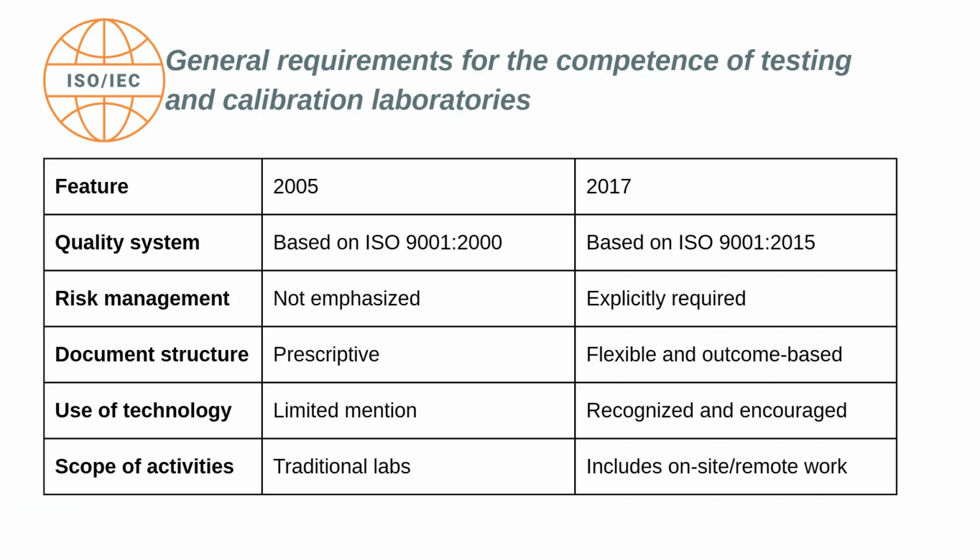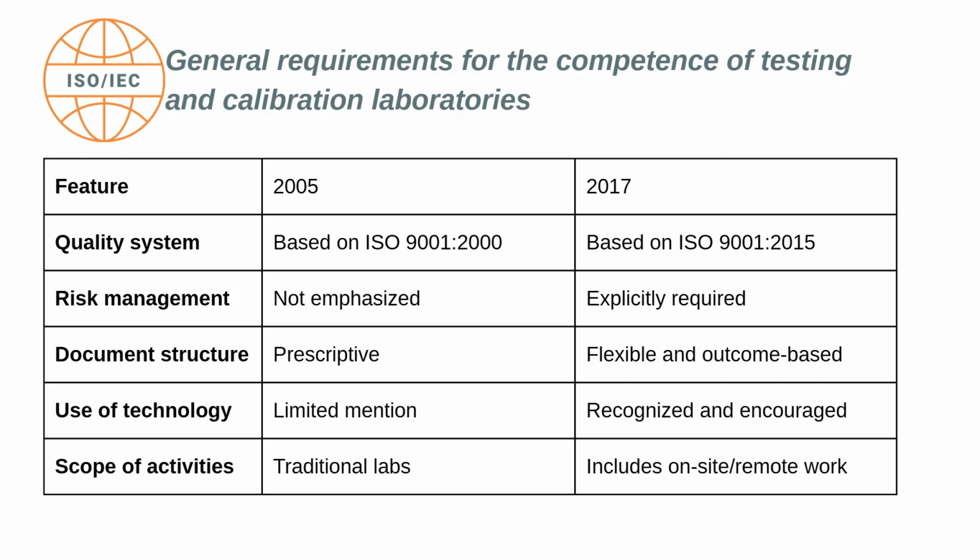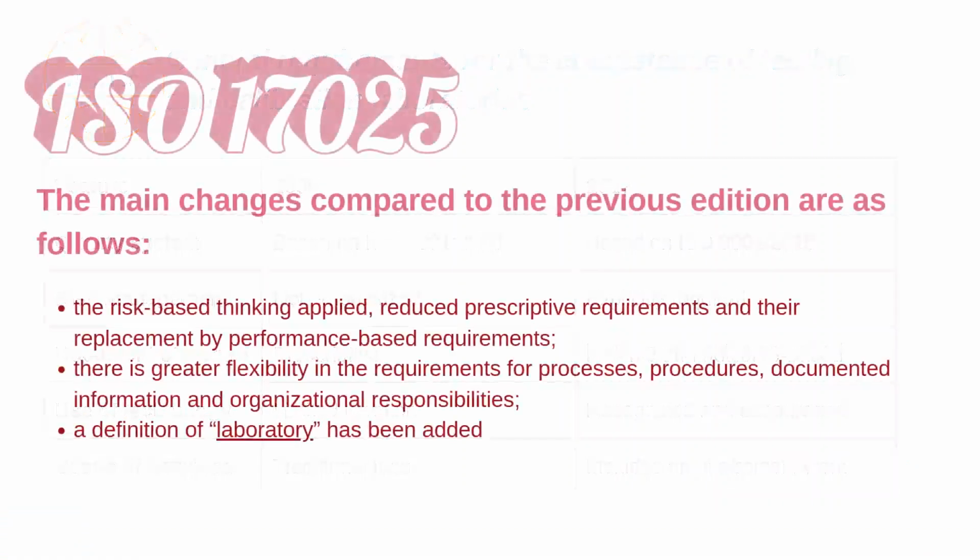Whichever is possible and acceptable can be considered under the scope of activity. So you don't have to have a traditional laboratory. If you have a testing and calibration lab on a van, similar to what IIT Madras has, it is also acceptable. So that is one advantage in the recent version, and we can enjoy that.